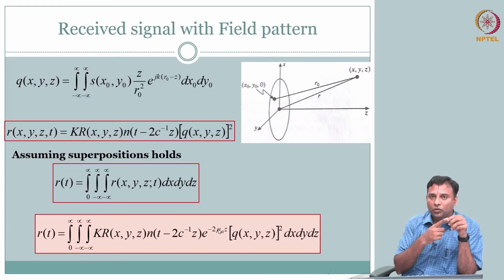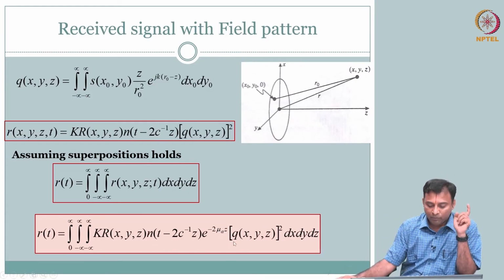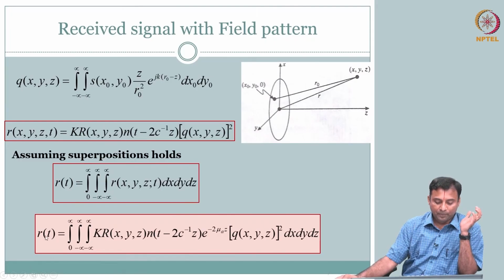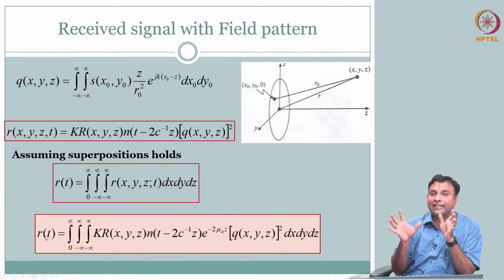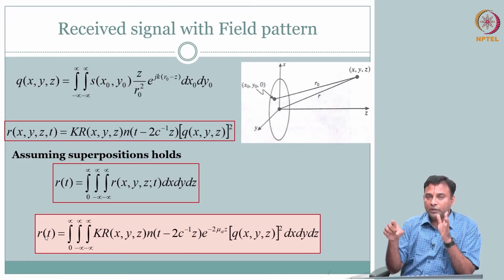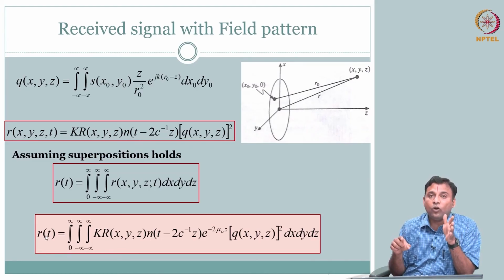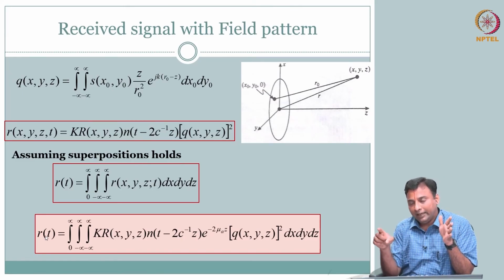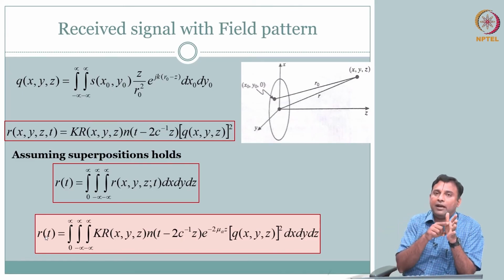So this is a pulse echo, and this is an important piece of information. With the time and distance, you always have to be careful, because the signal that you are receiving is an echo. The pressure wave would have travelled to that location, got reflected, and the echo comes back.